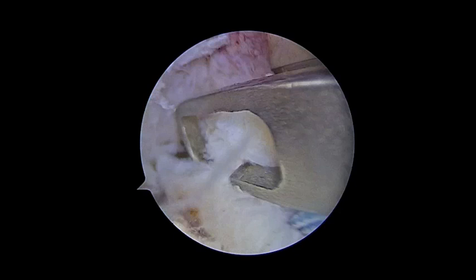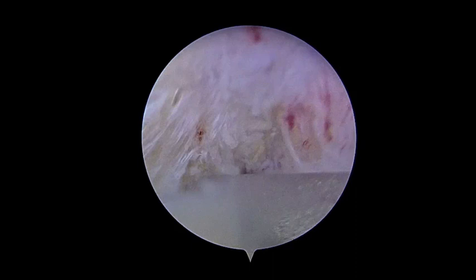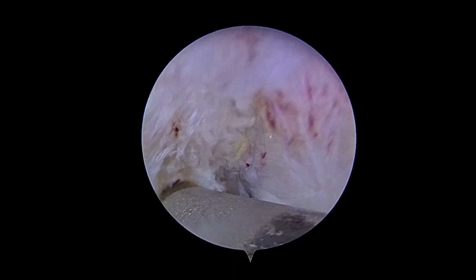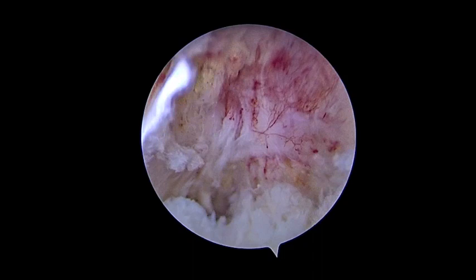We repeat the procedure with the same FiberWire number two, and finally we put a 2.0 FiberWire more proximal. We drill the hole at the AM bundle center, grab the remnant with the suture and with the SwiveLock, and put it all inside the AM hole.